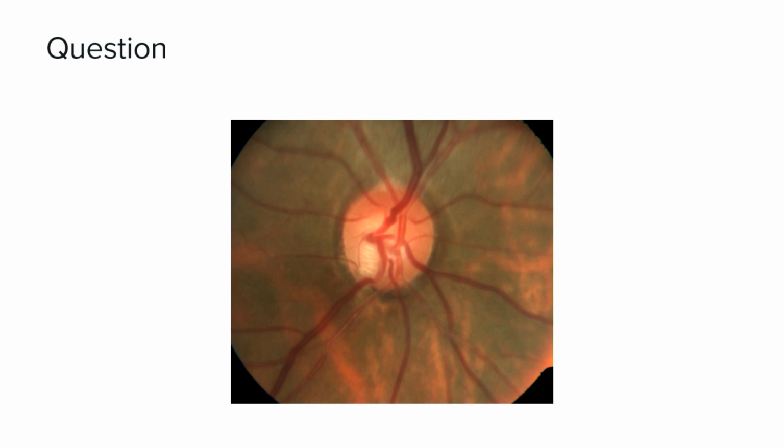Then, nerve fiber layer defect. Is there anything? Look at where the notch is. Do you see something? Inferotemporal. Yeah, maybe because it's a tessellated fundus. It's not very clear, but there looks to be an inferior RNFL defect. So is this glaucoma? Yes. If so, you will want to follow up and treat this patient.